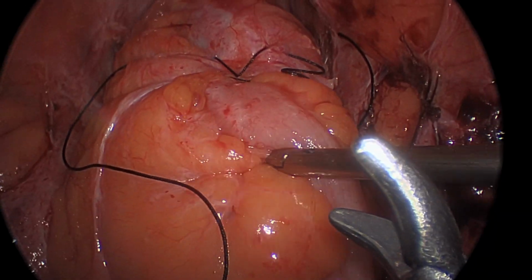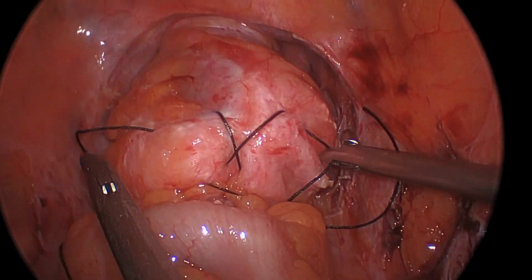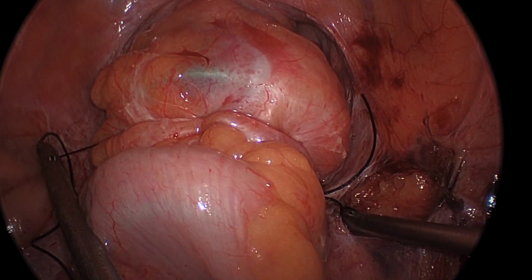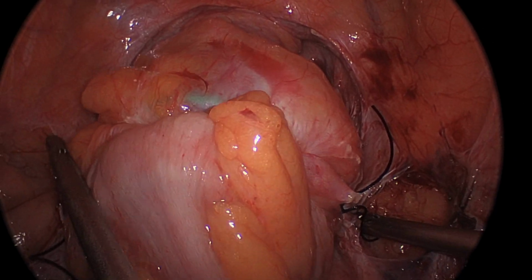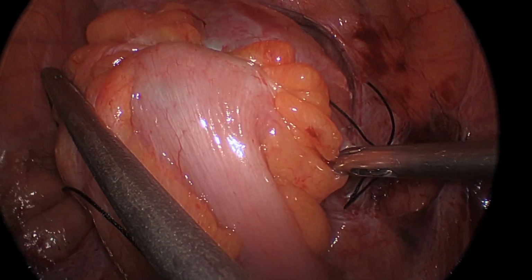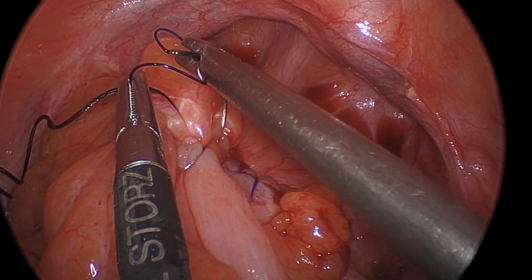A circular transanal stapler was then inserted rectally, with the head and tail of the stapler placed superior and inferior to the lesion, respectively. Attention was paid to ensure the partial anastomosis was appropriately aligned. Once the lesion was completely invaginated, the stapler was fired, resecting only the area of interest in a sterile manner. The region was then oversewed.